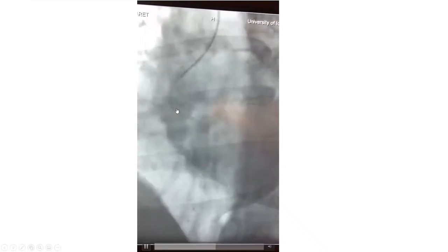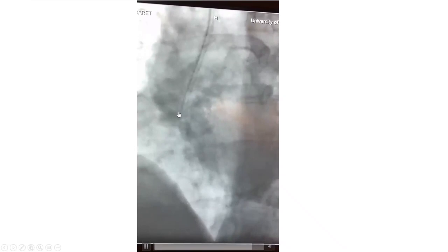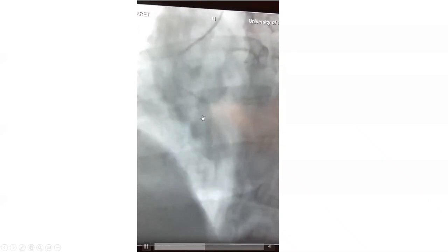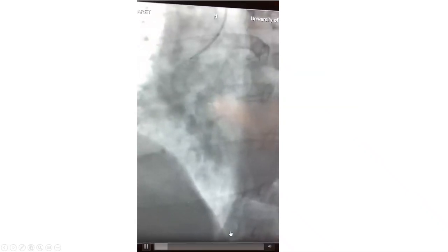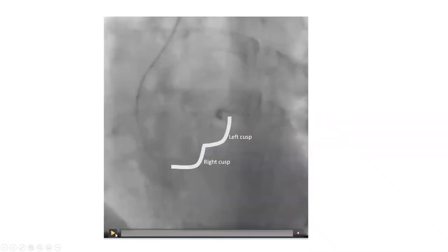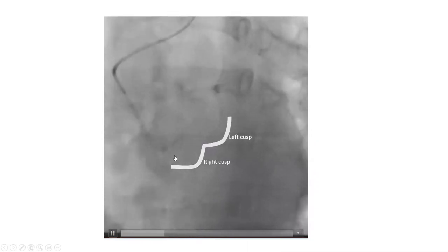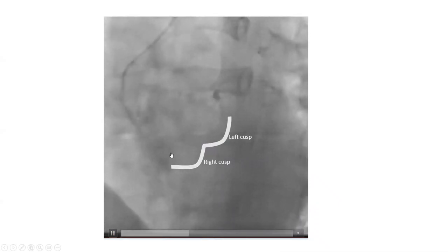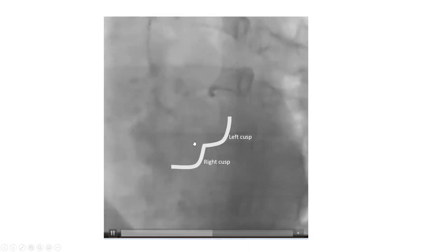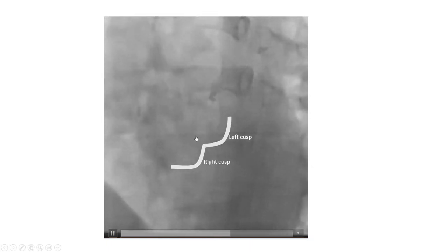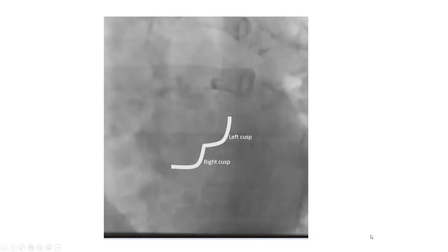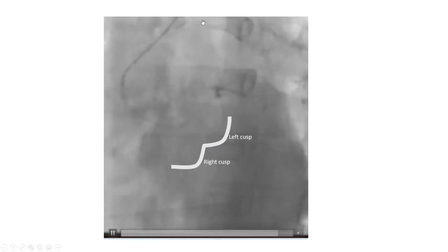It may not look smooth, but that's how it worked. If it doesn't work with this catheter — say JL4 or Tiger 4 — then downsize. It's easier to loop with a shorter arm Jutkins left. So if it's a Tiger 4, get a JL3.5 to do that looping if you couldn't engage from above or the catheter is unstable. This is another case in a patient with a short aorta. This is a Jackie catheter — we tried to push and loop from the right cusp, but generally we should try to jump into the left cusp first, which we did, and then looped from the left cusp to successfully engage.